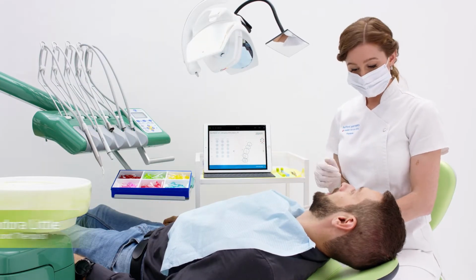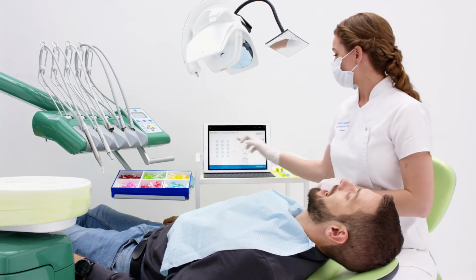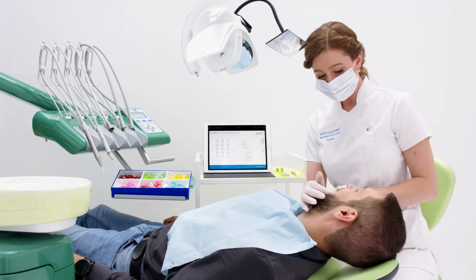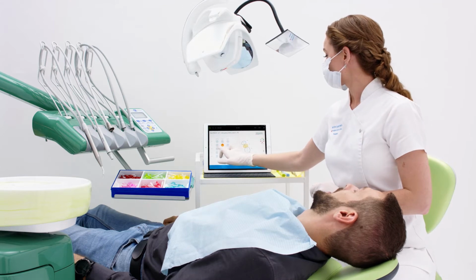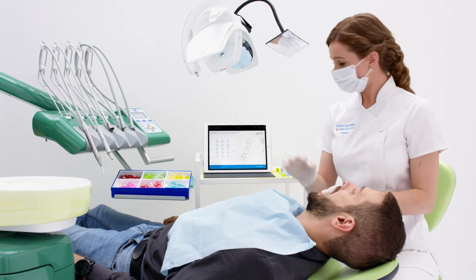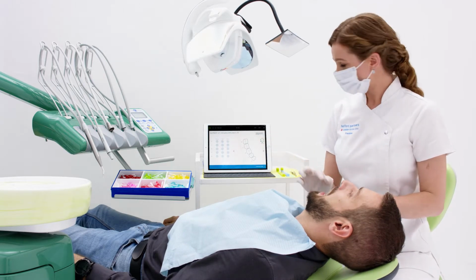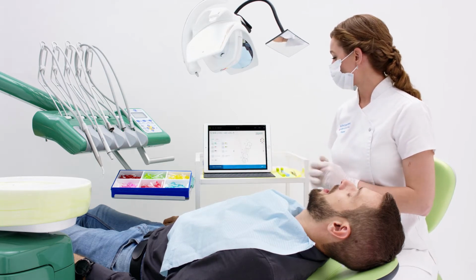The Bob Visual method includes a mirror in which the patient is able to view their mouth whilst you complete their Bob score. As Edward is a new patient with me today, I begin Bob by completing an intraoral examination. I've input into Bob any missing teeth, crowns and/or implants. This information is saved, and on future Bob sessions it will only be necessary to input any changes.